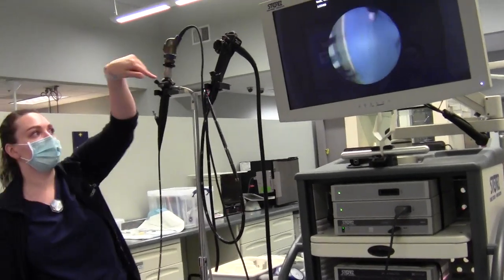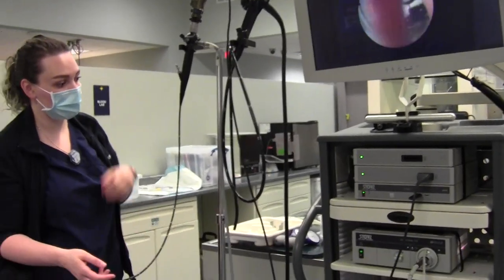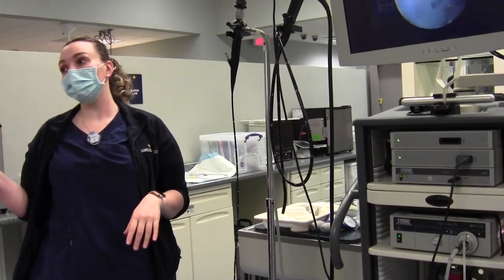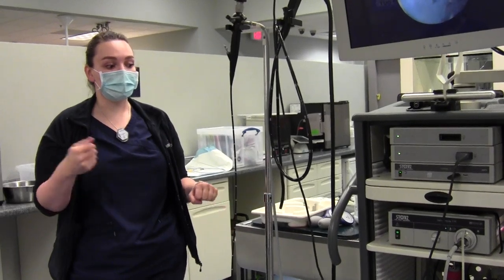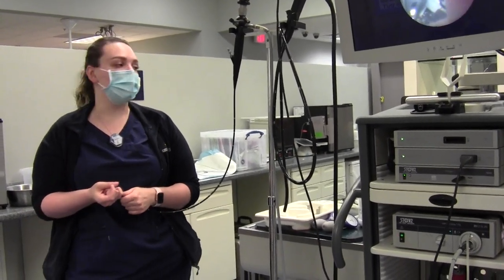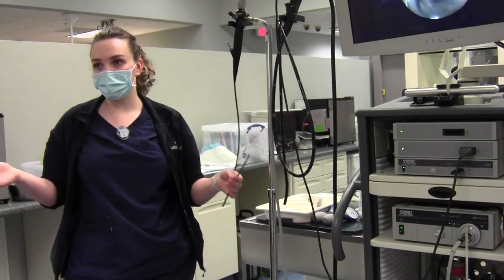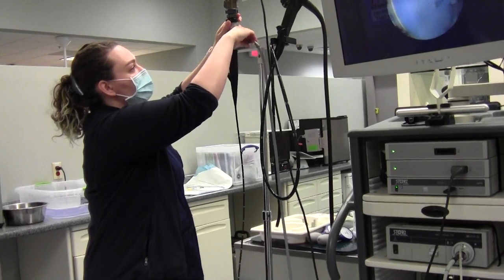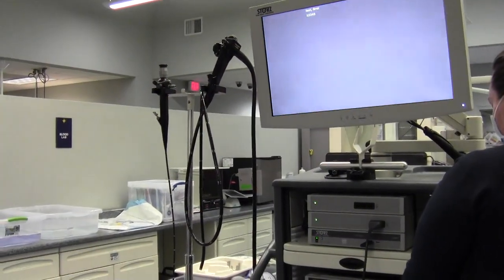So this scope is ready to be used — we would just hook up an external suction device on this end if needed. The most important part prior to any type of scoping is to pressure or leak test all of the scopes before and after any procedure. You don't know what someone else has done in a prior procedure, and during a procedure there's always a possibility that damage was caused. So when we go to clean the scope, we obviously don't want to submerge a broken scope so that fluid gets into the channels and breaks the wiring. To pressure test, you want to make sure that everything is detached before you do anything.